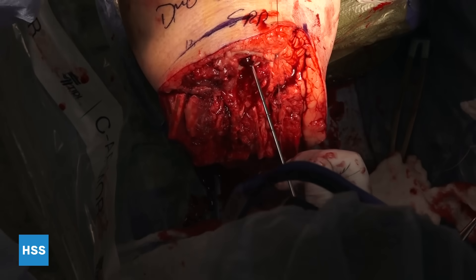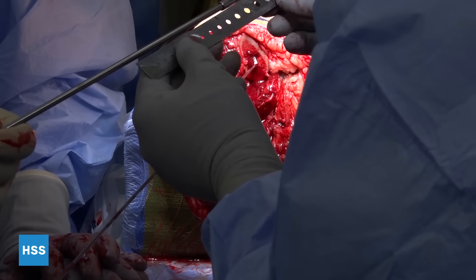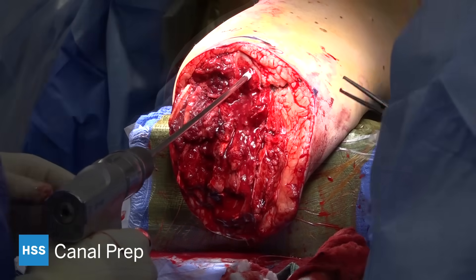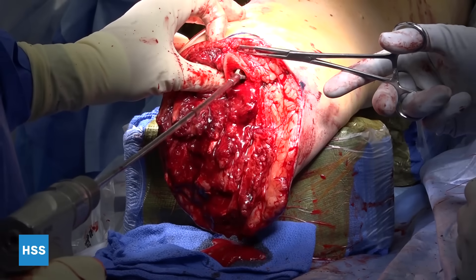Before reaming is started, the tourniquet is released. You can see we're starting to see a little bit of bleeding and we're obtaining hemostasis. The next stage is preparing the canal — here you can see some bleeding because the tourniquet is down.